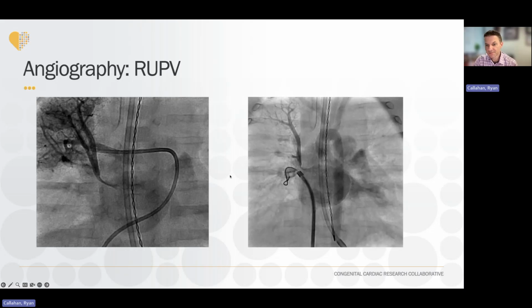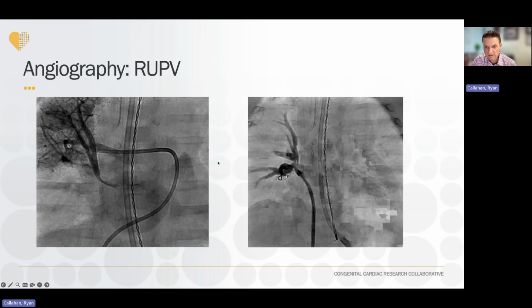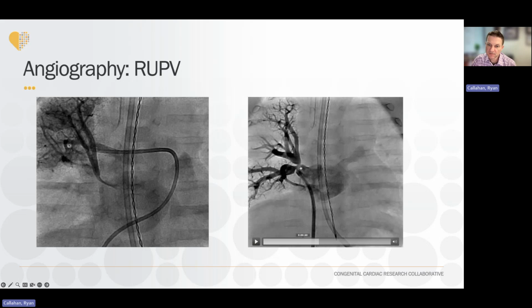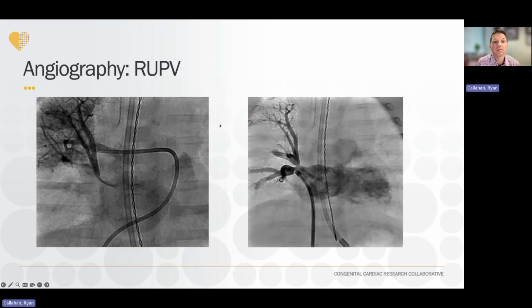This compares to the same patient where we have a retrograde picture, which is much better. And so try to use these when you have them to grade your stenoses. And you can actually see that the vein connecting to the heart is wide open. However, upstream of that, you have narrowing of the upper and the middle here. And so there is segmental disease in this patient, which by default will be severe. So we're going to call this severe.